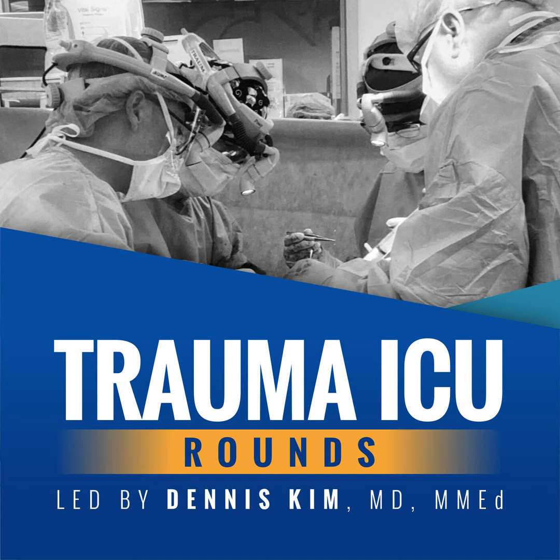Regarding triggers, the trigger really describes the changeover from expiration to inspiration. And the trigger may be either the patient or it may be the ventilator. It really depends if patients are spontaneously breathing or not. If patients aren't spontaneously breathing, then the trigger essentially is going to be based on time. So if we set a rate of 12, that's a breath every 5 seconds. If the patient's paralyzed, not breathing on the ventilator, they get a breath every 5 seconds.